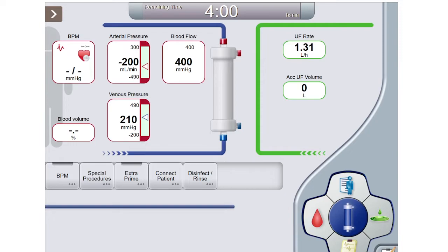All right, so for this next section, what I'm actually going to do is utilize the HemoControl simulator, which is available on the Kidney Campus website. If you haven't seen it before, I'd highly recommend that you check it out. And I will be providing a link to the HemoControl simulator. There are 3 case scenarios available, and we're just going to be utilizing one of them, for which I've taken some of the information for our PowerPoint.